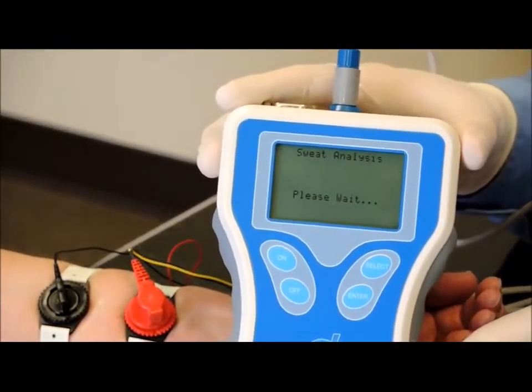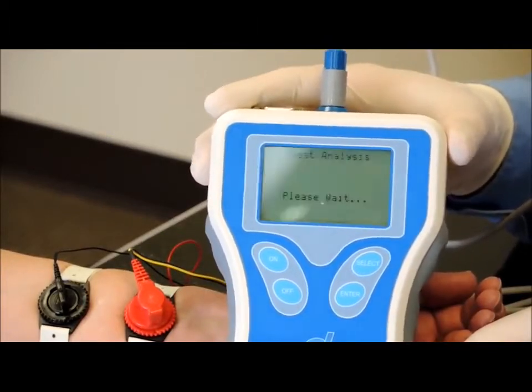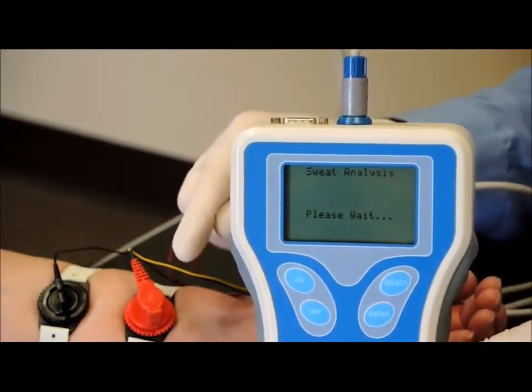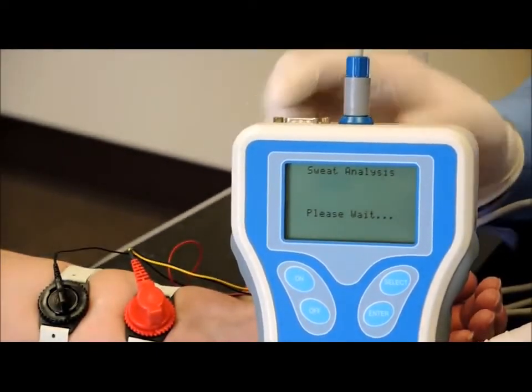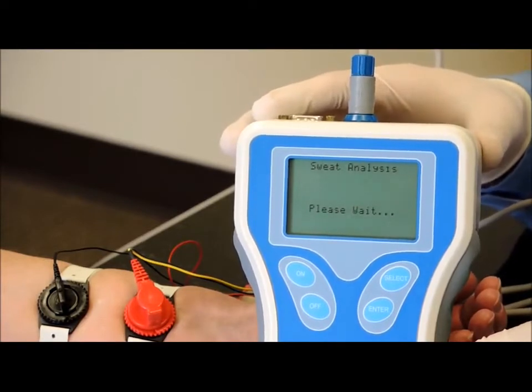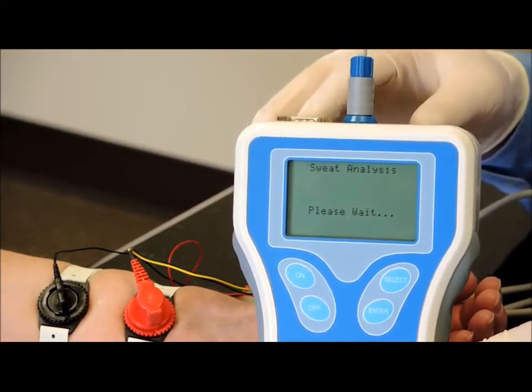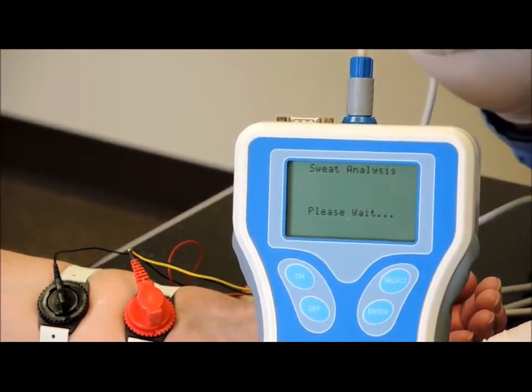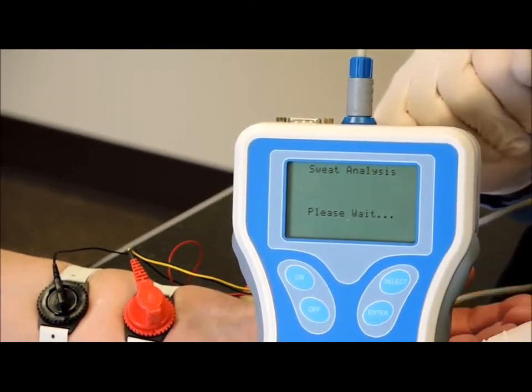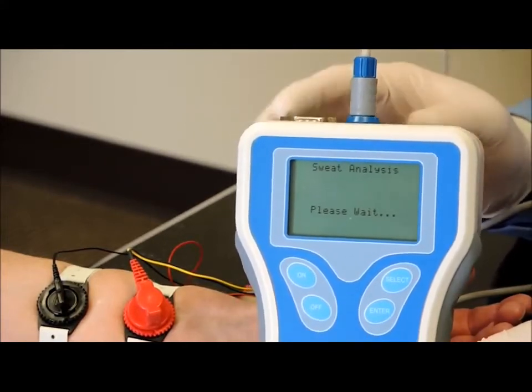This time can vary depending on how fast of a sweater the patient is. It will stay on this screen until sweat has gone to the first electrode in that sensor cell. And then you'll see the screen say sweat at first electrode. And then after that, as the sweat progresses to the second electrode, once it hits the second electrode, it will start showing values and the sweating rate, and it will take values for 8 minutes.